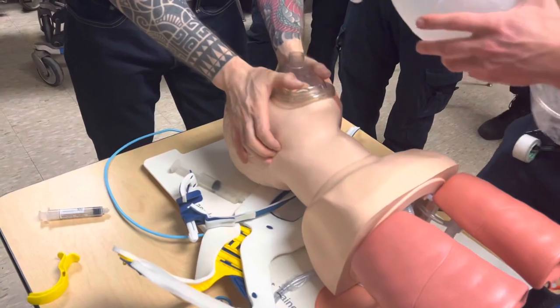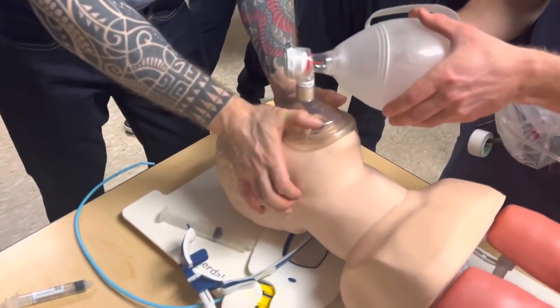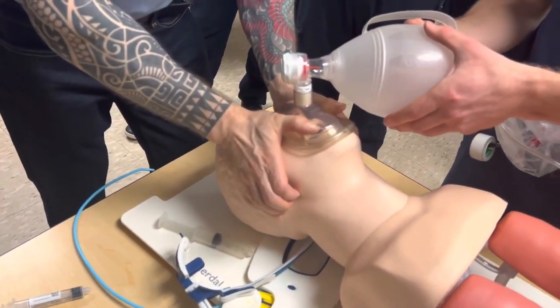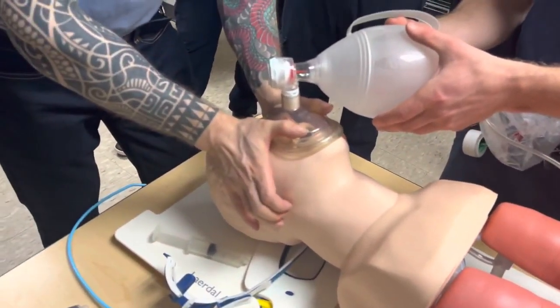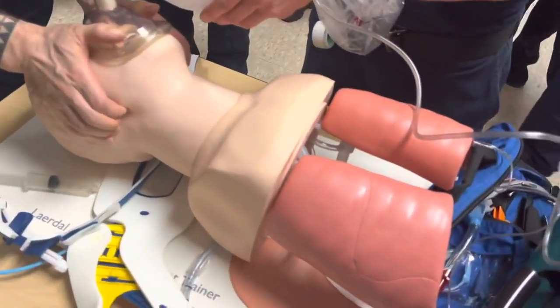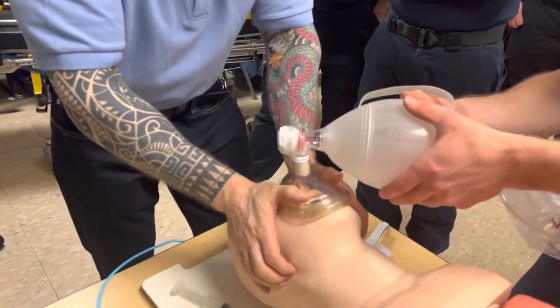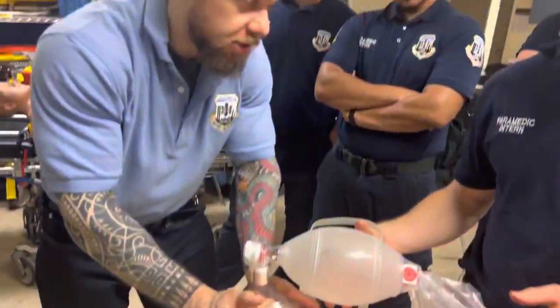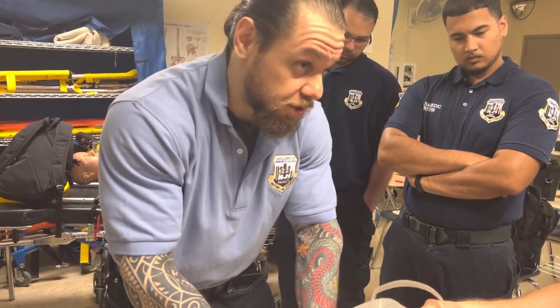Connect the BVM. So if I was going to pre-oxygenate, I'm going to say squeeze on 6, right? And you're going to see what I'm going to do. 2 1,000, 3 1,000, 4 1,000, 5 1,000, 6. Again, 2 1,000, 3 1,000, 4 1,000, 5 1,000, 6. So you notice on 5 I engage, on 6 he squeezes, then I relax, because if you keep this position, your fingers are going to tire.